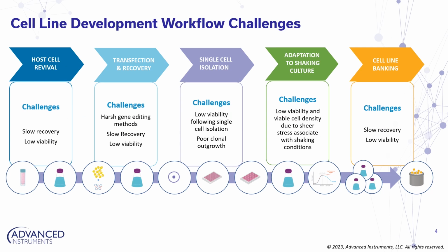Right from host cell revival, cells can suffer with poor viability following the harsh conditions which accompany cryopreservation. As a result, scientists often must wait several days or even weeks for the cell's viability and viable cell density to recover before they can proceed with host cell transfection. Right from the start, this can make the process slow to kick off.